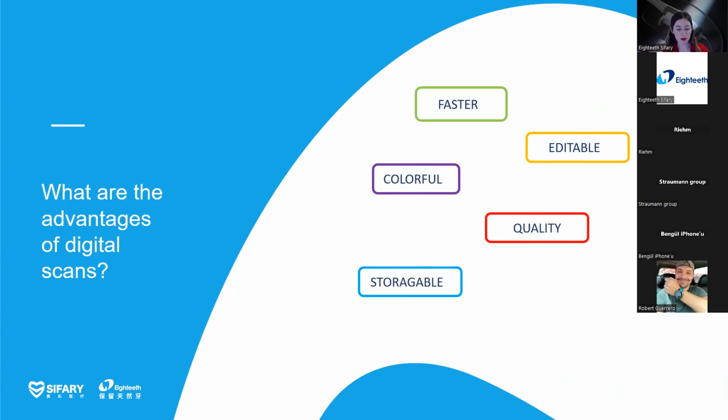I'm going to talk about that now, but we are working on cloud-based storage. Basically, doctors can store their scans and models in order to save them. Believe me, it works, and already all the dentists have to save them for at least, it can be different for all countries, but at least 1 year. Why so? Because anything could happen and they can rework again on the same model.